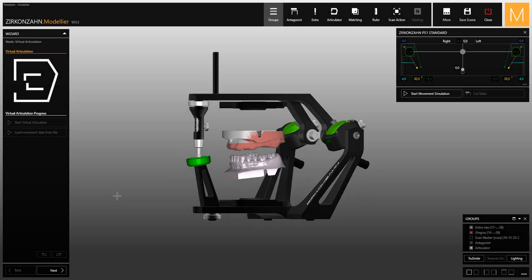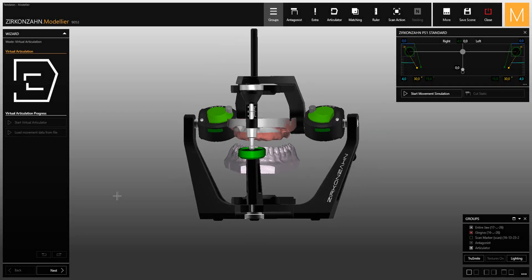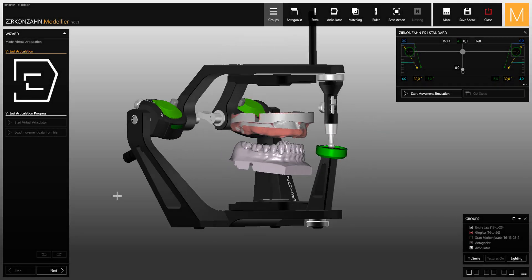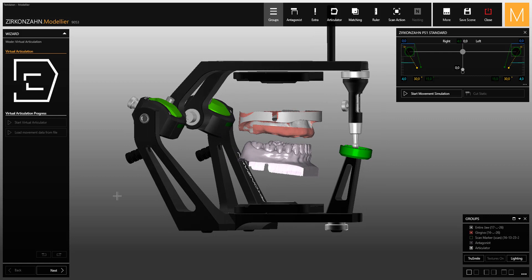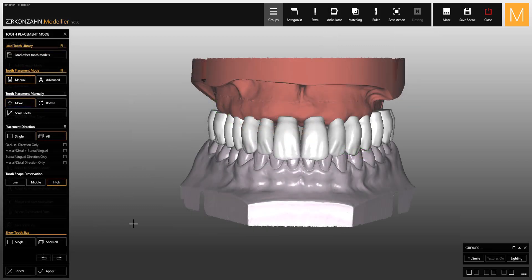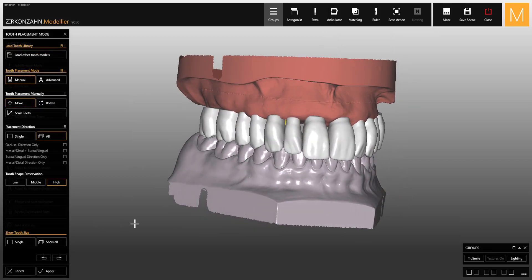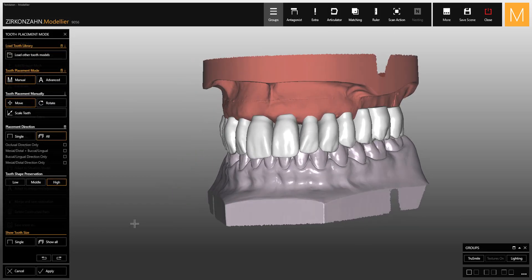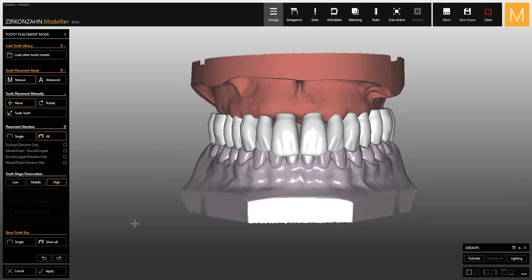This video shows the new Zirconzan articulator window and explains how to use it. If you have already selected the virtual articulator in the archive software, the wizard will display it directly. Otherwise, you can open the virtual articulator manually.